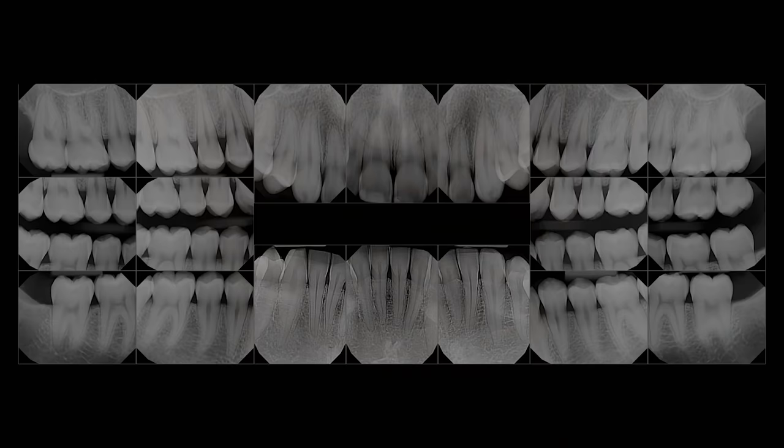This concludes our full mouth series using the DEXAS Titanium Sensor by CAVO.